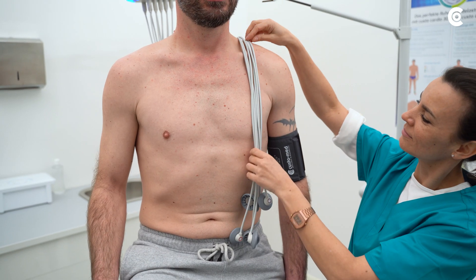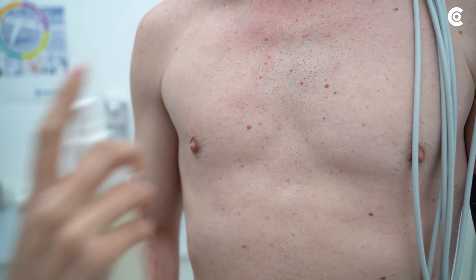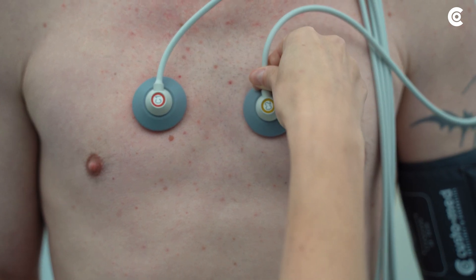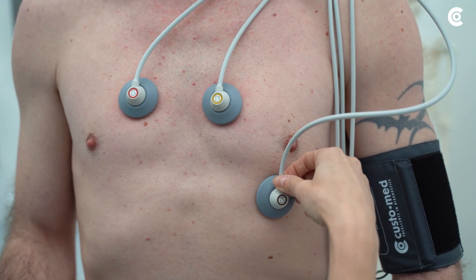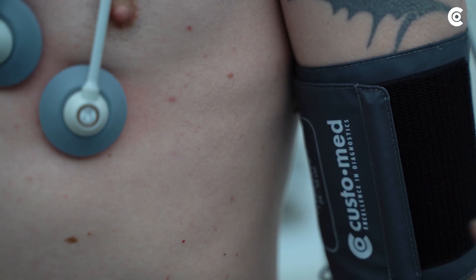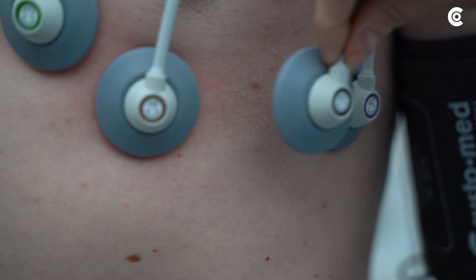Then place the electrodes according to Wilson. The electrodes V1 to V6 are placed on the chest wall as follows: V1 in the fourth intercostal space at the right sternal border; V2 in the fourth intercostal space at the left sternal border; V4 in the fifth intercostal space on the left mid-clavicular line; V3 left on the fifth rib between V2 and V4; V6 left on the mid-axillary line at the level of V4; V5 left on the anterior axillary line also at the level of V4.